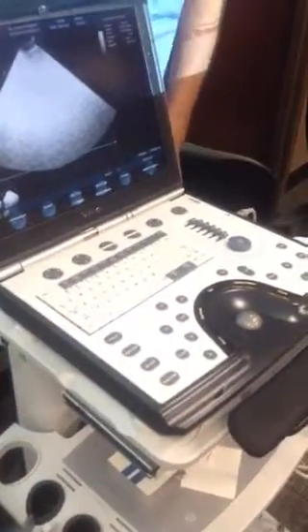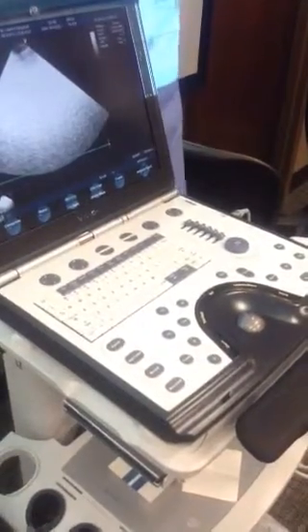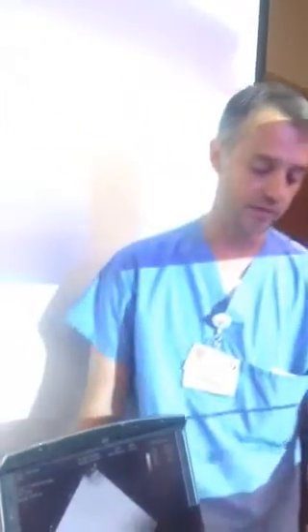The first time you do it, you're just going to be hitting store, and you can always go back and edit. One of the biggest things I see novice sonographers run into is they ask, why can't I get a picture? They put the probe down. It's because their depth isn't right. You might be too far away to get the picture, or you might be too far in. Your depth button's right here.